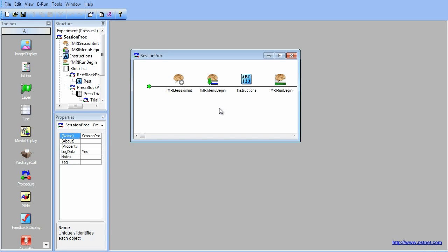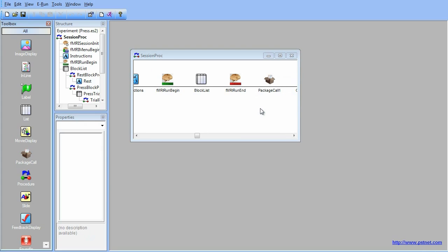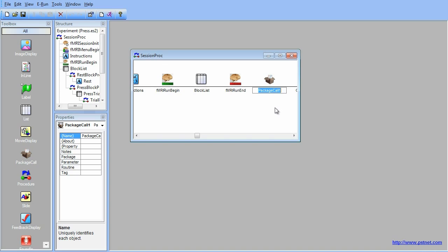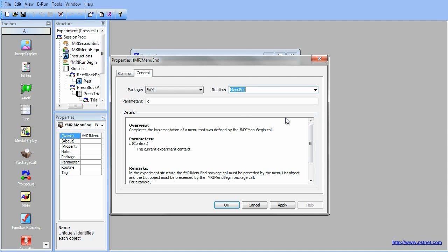Now that the Menu Begin Package Call has been created, a Menu End Package Call needs to be created. Drag a Package Call object from the Toolbox and place it before the Goodbye text object. Rename the Package Call fMRI menu end. Open the Package Call Properties page, change the Package drop-down to fMRI and the Routine drop-down to Menu End. Click OK to accept the changes and exit.